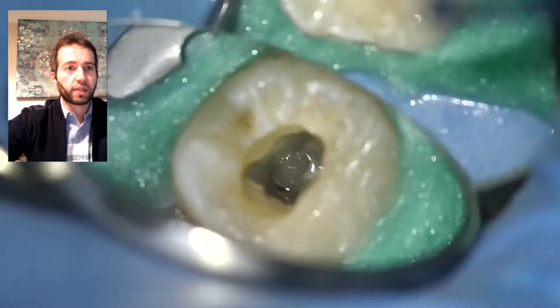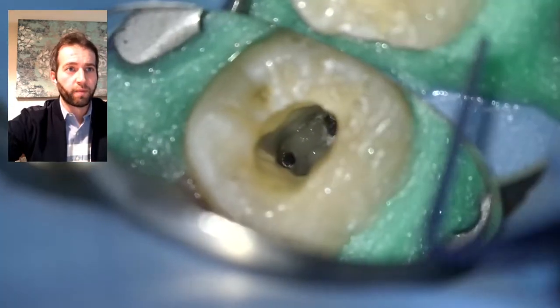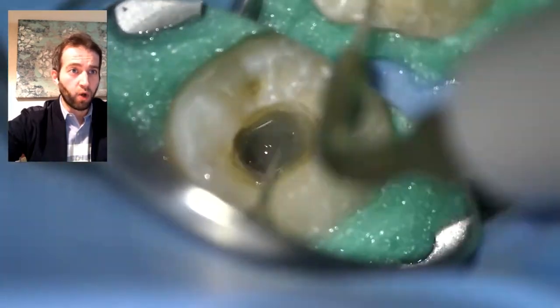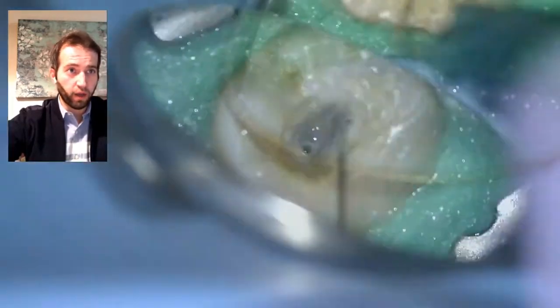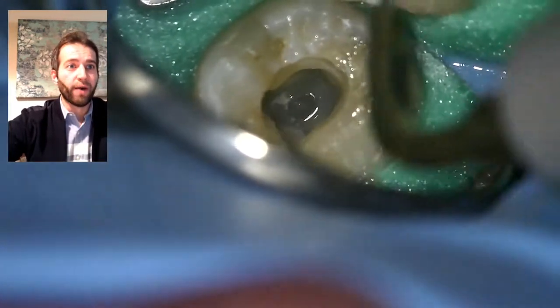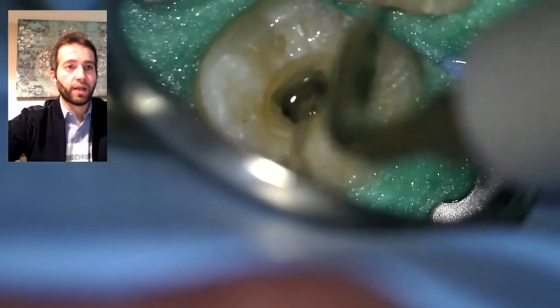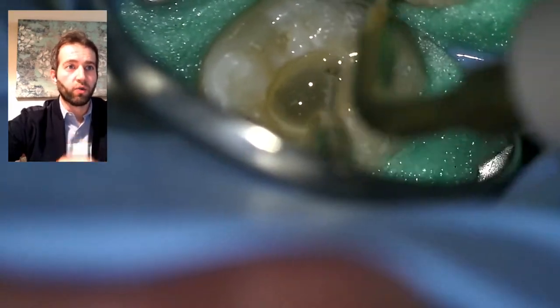The best way to remove calcium hydroxide is to use sodium hypochlorite. There are still some pieces on the walls of the canals that are dried out, so I use an ultrasonic tip called an Air Safe — it's very thin. I do rounds and rounds of replenishing sodium hypochlorite, and as you can see, it gets cloudy when I apply this ultrasonic tip. The cloudiness means there's still some debris.